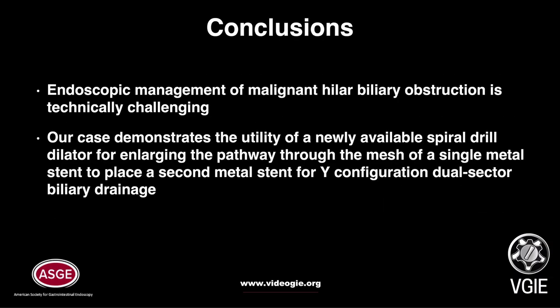In conclusion, endoscopic management of malignant hilar biliary obstruction is technically challenging. Our case demonstrates the utility of a newly available spiral drill dilator for enlarging the pathway through the mesh of a single metal stent to place a second metal stent for Y configuration dual sector biliary drainage.